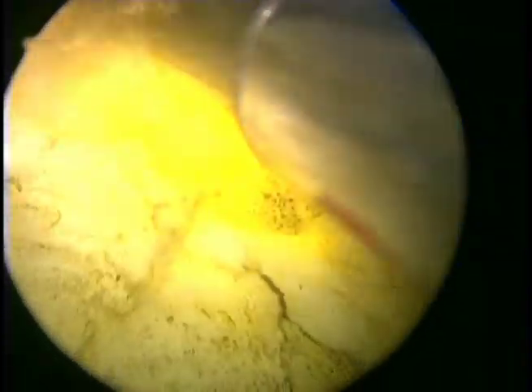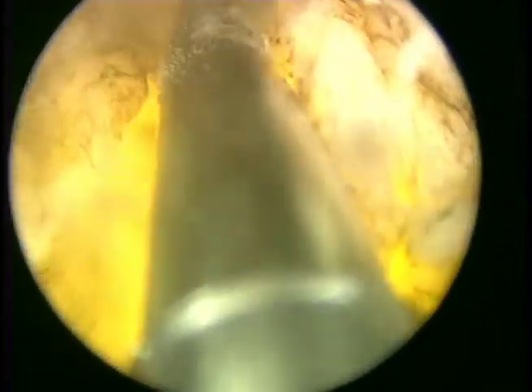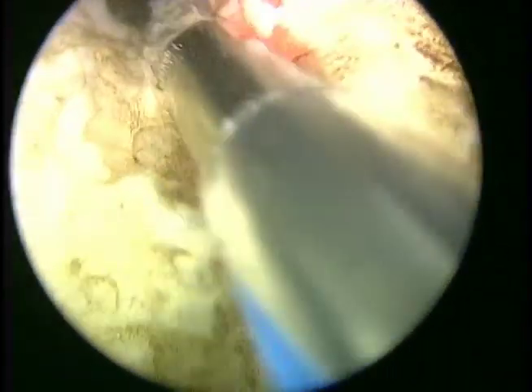Here we can see that there is a small layer left of transition zone tissue, and so we'll dive down a little bit more now that we've created a large working space, to really ensure that we are in the right plane. This will be carried along that plane to the right of the screen, therefore toward the left lateral lobe, to ensure that we really resect the lower floor of the prostatic fossa.